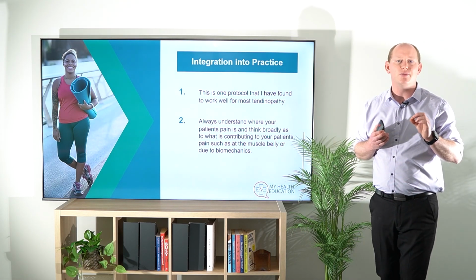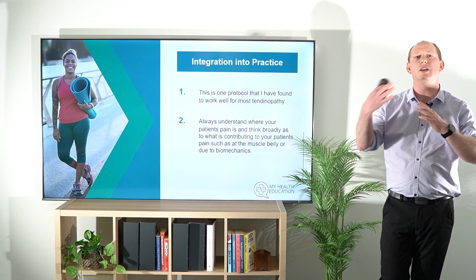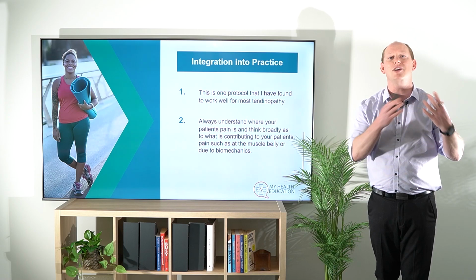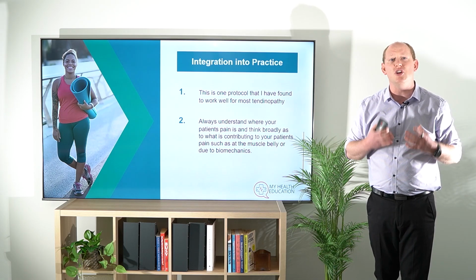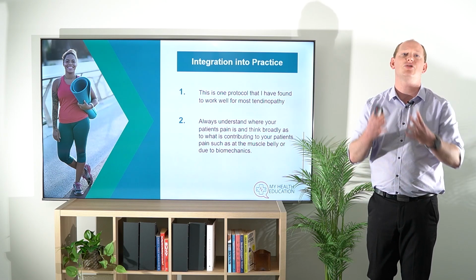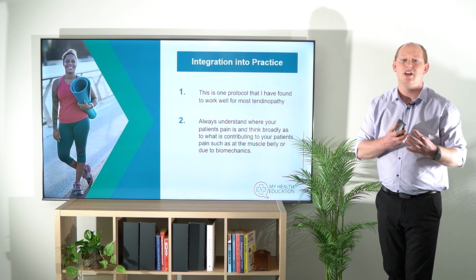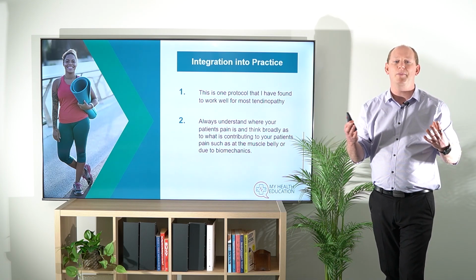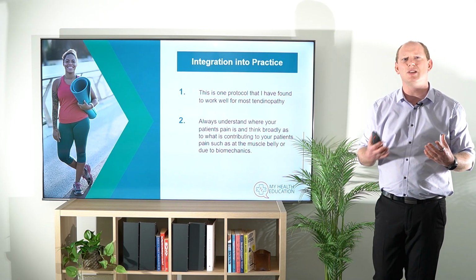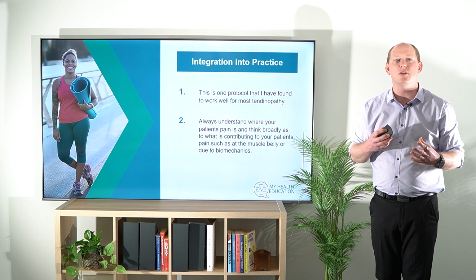Hopefully this has given a little bit more of an idea of the protocol that I use. I think, looking at the site of injury, as well as then coming up and double checking the muscle belly, is really important in all of our tendinopathies. You can't just treat the insertion, you must treat where some of that pain is coming from, which is at the muscle belly. Start thinking broadly about the biomechanics and how you can unload that tendon completely, or that muscle, by shifting how people are walking.